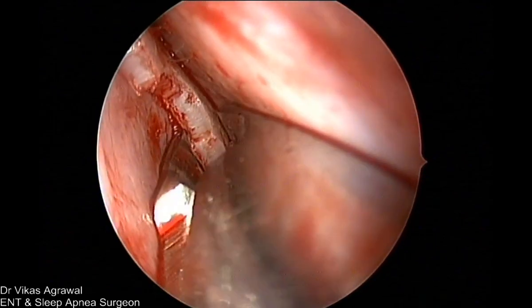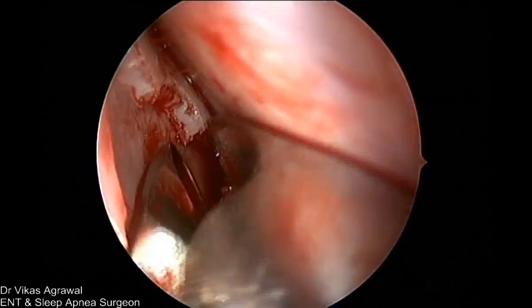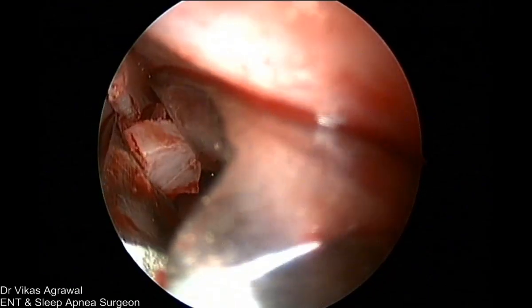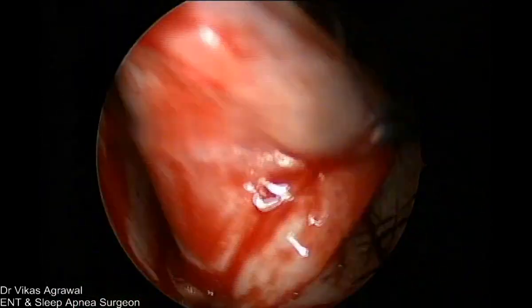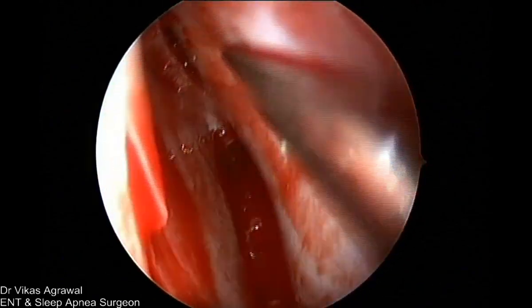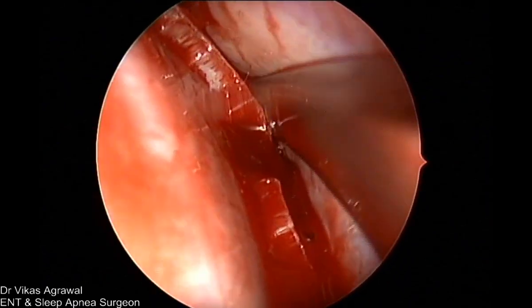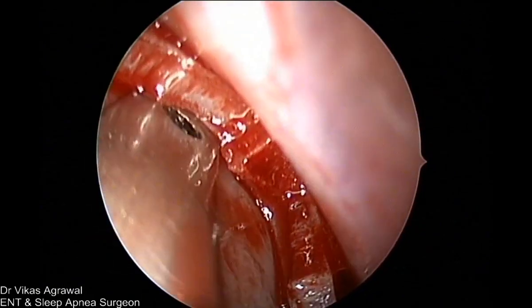Right. Okay, can you see this? This is the cartilage. How much cartilage have I removed? But believe me, there will be no problem of shape at all. Even if I come anterior, I'll just leave this part which is below the cartilage. This is the upper lateral cartilage, and that's where the nasal bones start, right? So now I'll show you on navigation where we stand. Now this is the bone. I have already reached the bone.